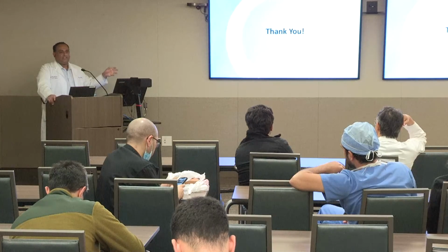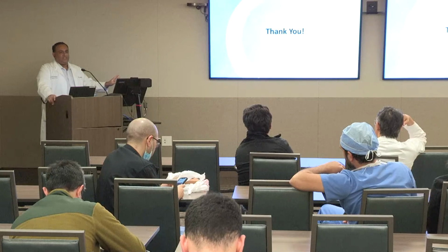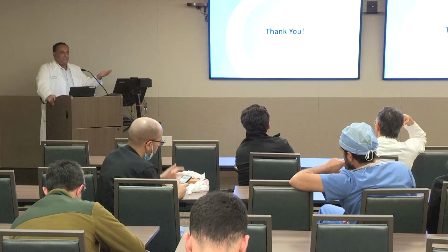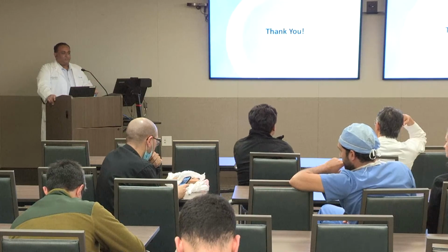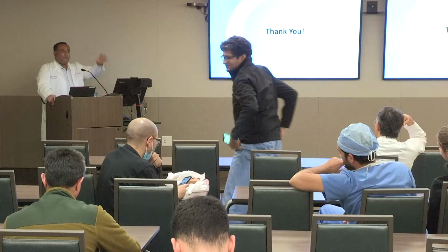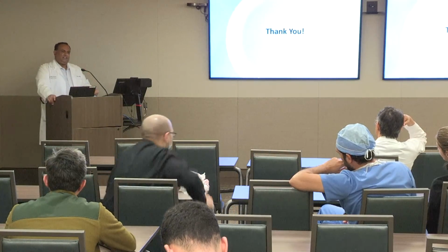You don't have to look at a table for that. I think just the stenosis and the plaque assessment is enough. And then, of course, there's other pathology or abnormal CT-FFR, you'll report that. But if you've made your report totally in that format where it's just a lot of scores, I don't think that really helps the clinicians.